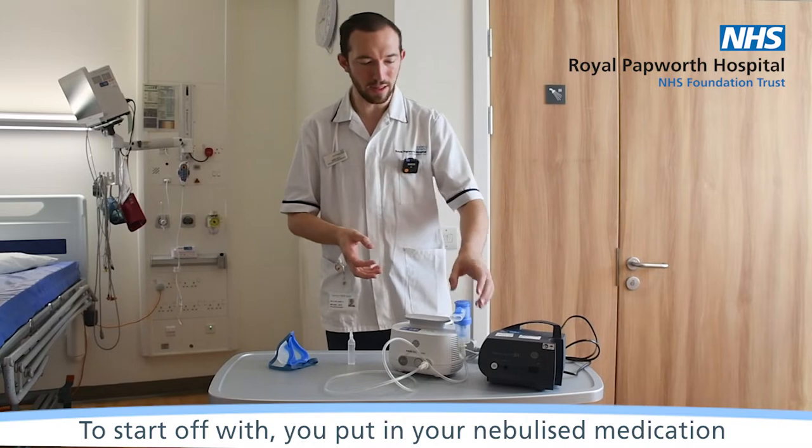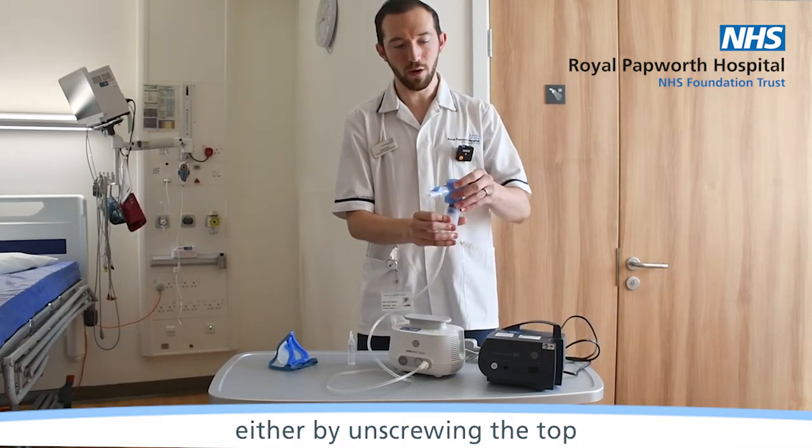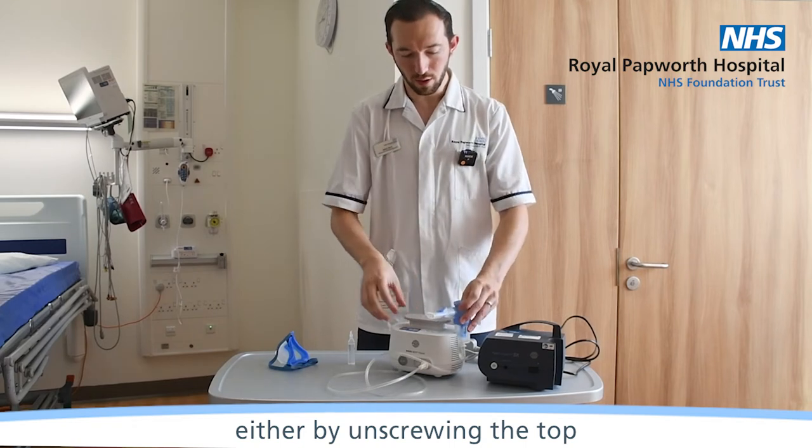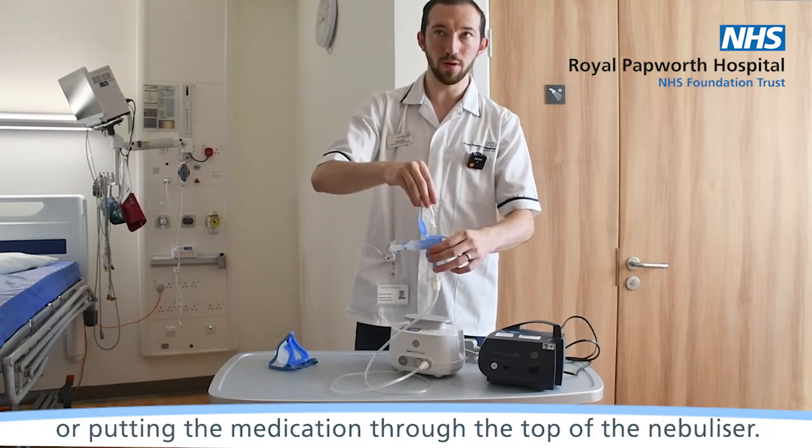To start off with, you put in your nebulised medication either by unscrewing the top or putting the medication through the top of the nebuliser.